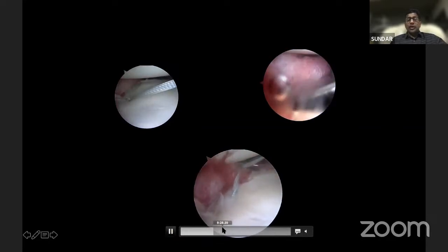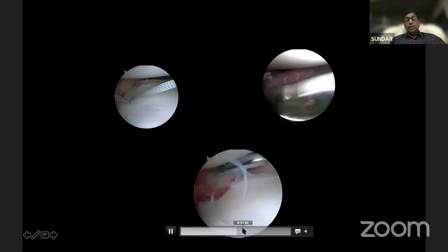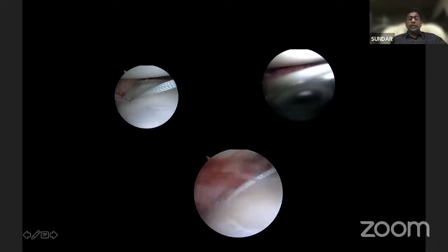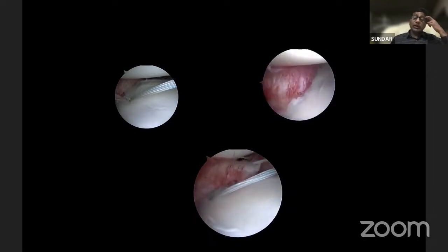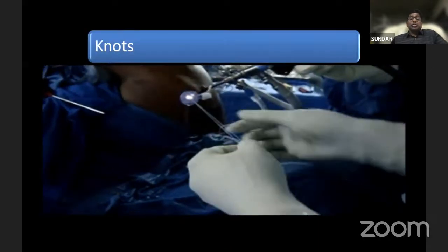You don't come into the glenoid side because that can irritate your glenoid. So that is how you can pull your labral tissue superiorly so that you don't get any slack over there. Then repair your anterior inferior labral, your 6 o'clock. Then I tighten the 7 o'clock position.